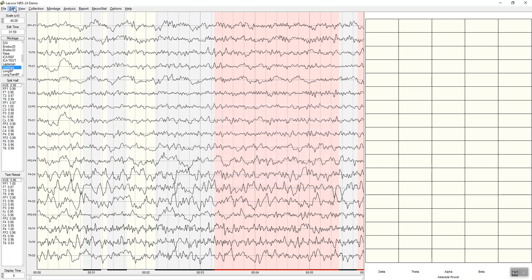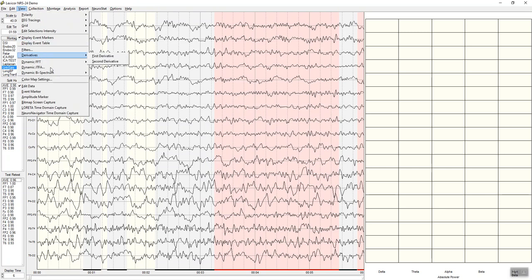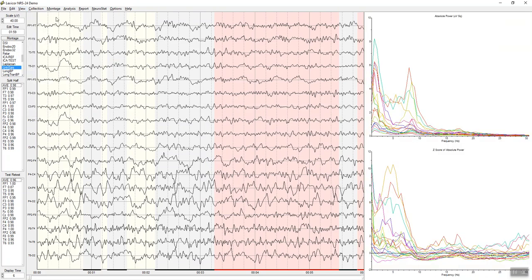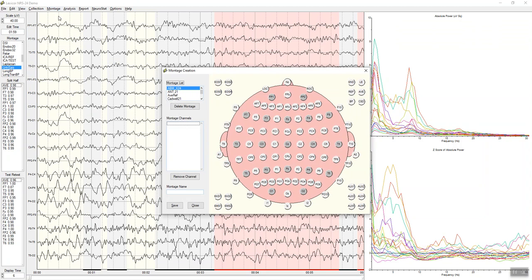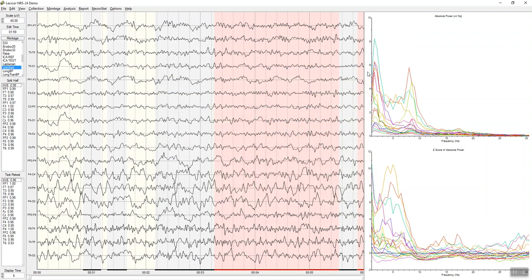I'm going to go back to the Dynamic FFT and you can look at different montages. In this case, you can go up to 85 different selections for the 10-10 system, but we also import up to 128 channels.